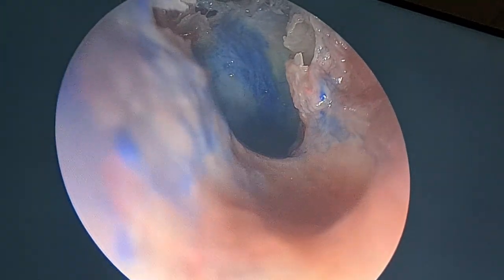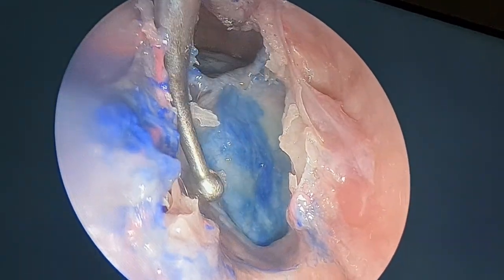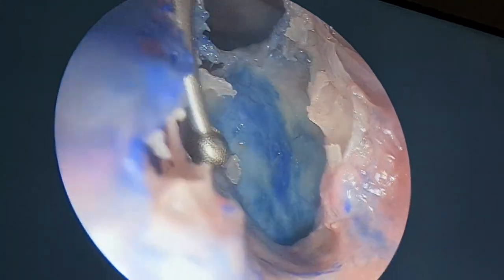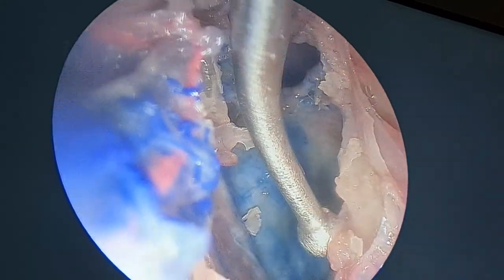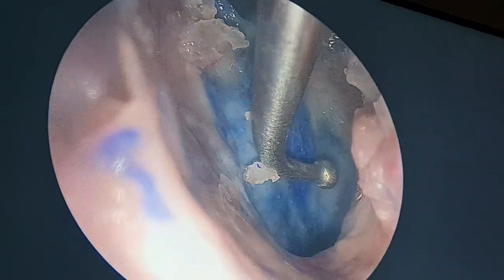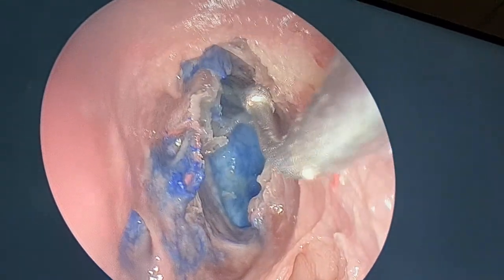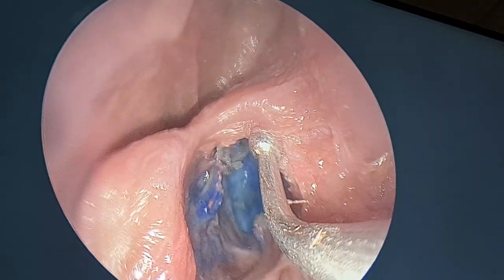See this structure, coming out obliquely from the orbit and going up there, that is the anterior ethmoidal artery. Why am I saying so? Even without confirming it, because this is immediately caudal to the supraorbital recess. So again, for everybody, this is 45 degrees. This is the first thing. See, why I am saying simple? This axilla anybody can identify.